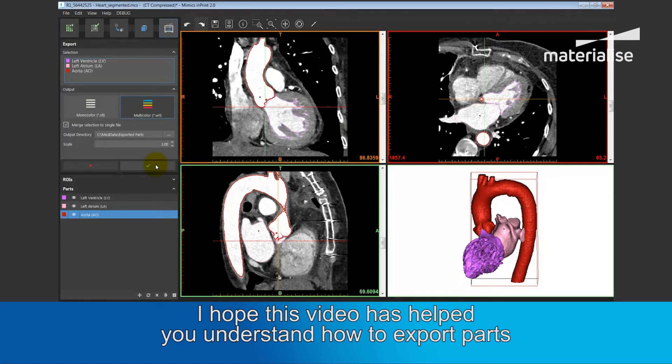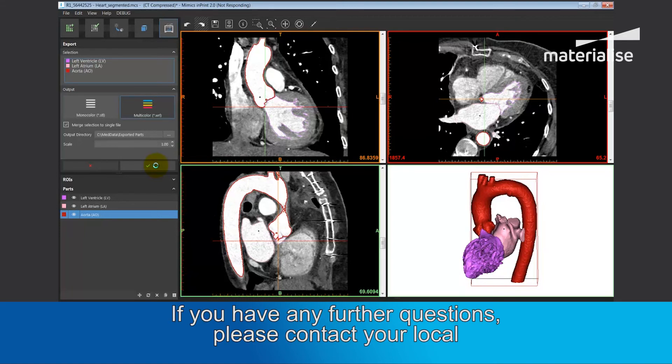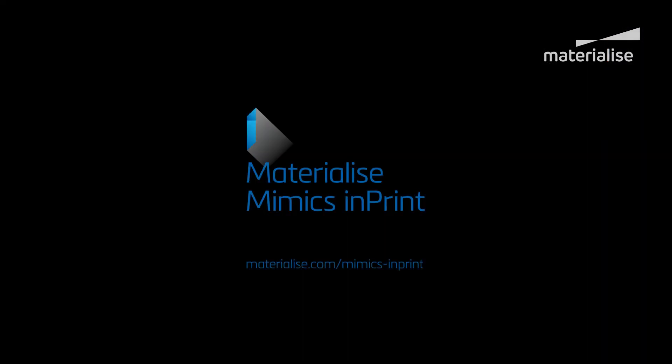I hope this video has helped you understand how to export parts with or without color information. If you have any further questions, please feel free to contact your local Materialise representative.